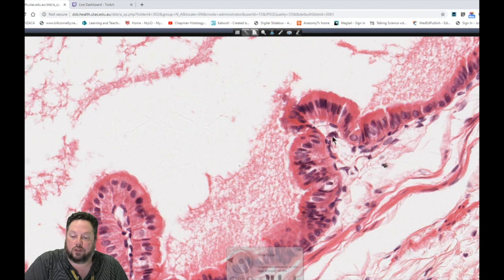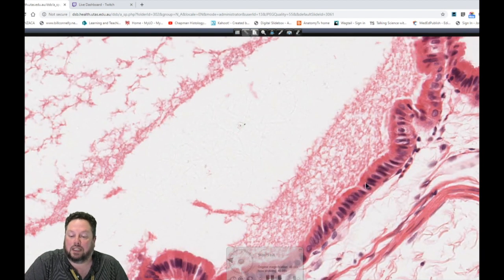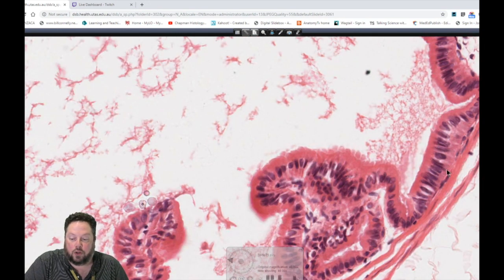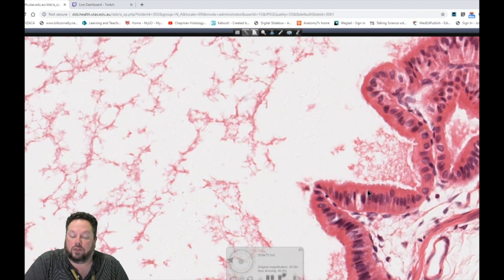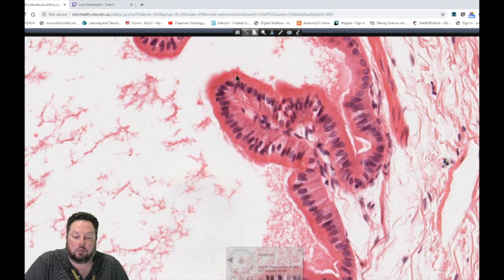And that's because the cells are absorbing so much water that they can't move it down the osmotic gradient. And so they keep it laterally between the cells. So it has a mucosa of this simple columnar epithelial lining. There's no goblet cells present within the gallbladder. So this is one of the ways that you'll distinguish it from a section of the small intestine, for example.